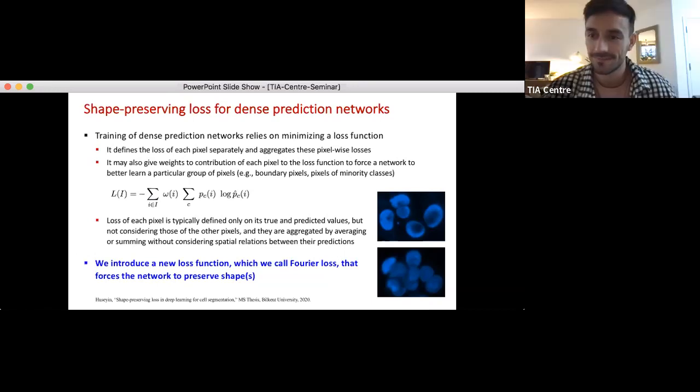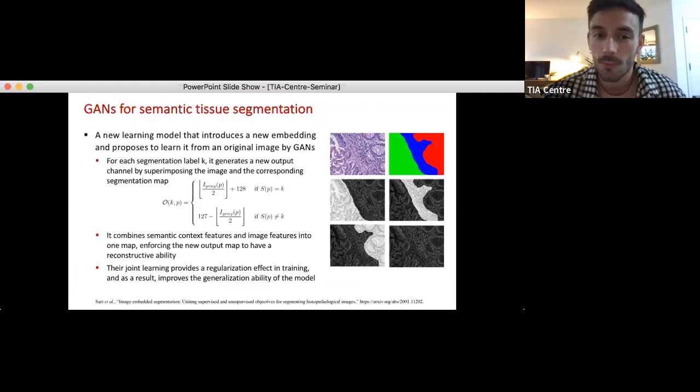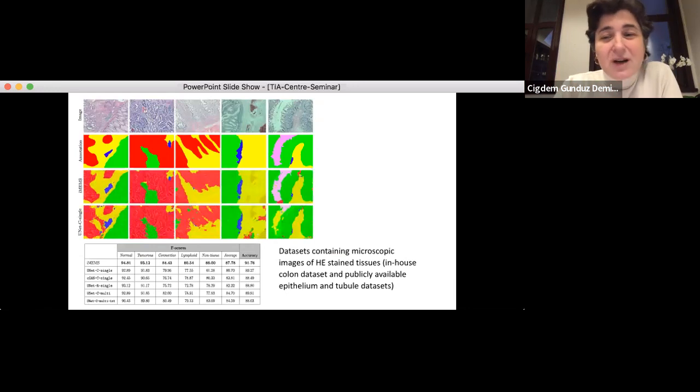Okay, great, thank you. So I'm also wondering. You spoke about the GAN-based method for segmentation, which is really interesting. So when would you recommend to use GAN-based segmentation, and when would you say that it's not needed? It depends on the application. So here, if you want to keep the image details somehow, we compared it with different approaches.